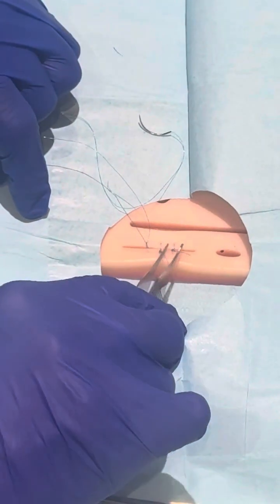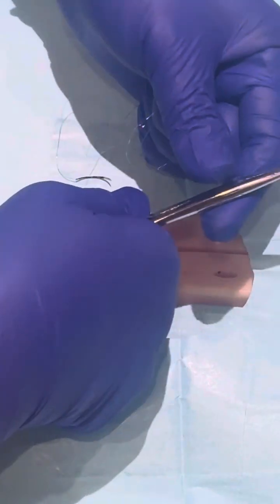Let me remove this one first. It anchors the other suture, so make it clear. It's not going to anchor on the other tie.